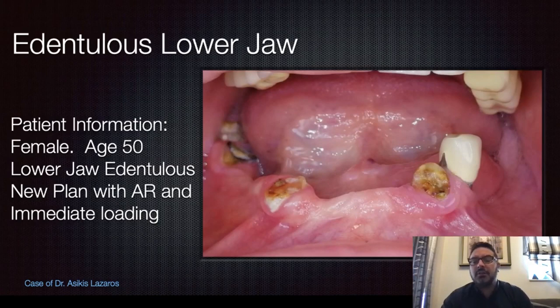In this case, there were 3 labs involved. One lab was Digital Aesthetic, Michalis Papastamos, for the surgical guide. Pantelis Xidas lab was for printing and making the digital RP analogs fitted into the 3D printing model. And the lab of Stratos Hadjihristos, who made the provisional.